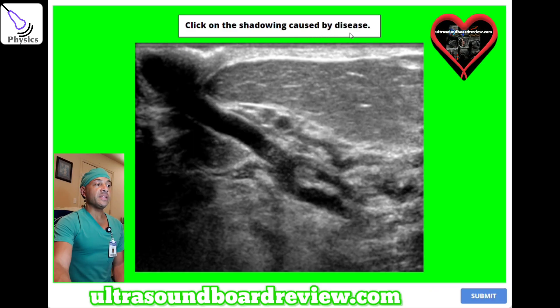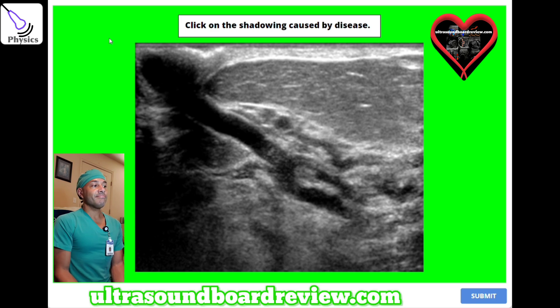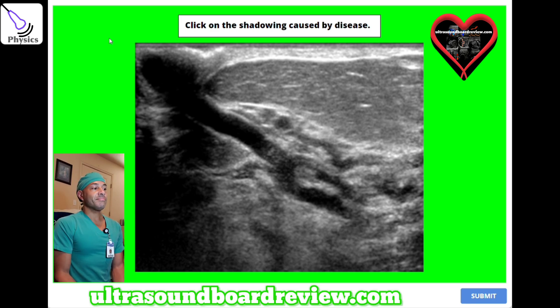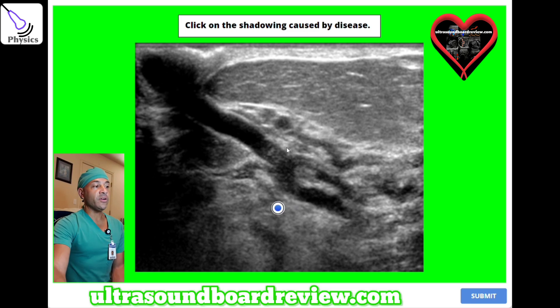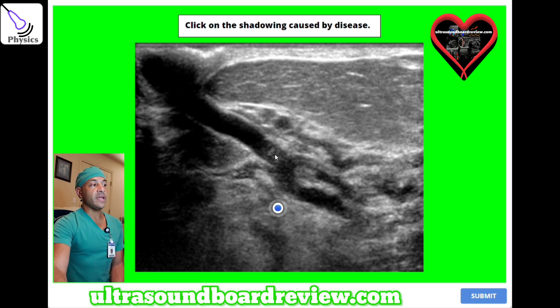Click on the shadowing caused by disease. The answer is right here — because this is a tumor, and this is just a rib. So to answer this question, click on the shadowing caused by disease — this will be the correct answer.